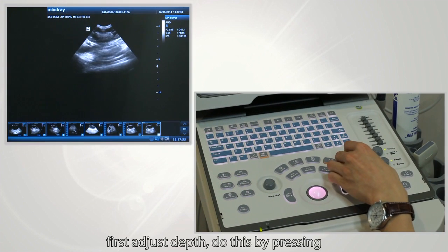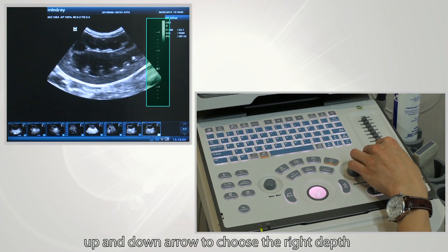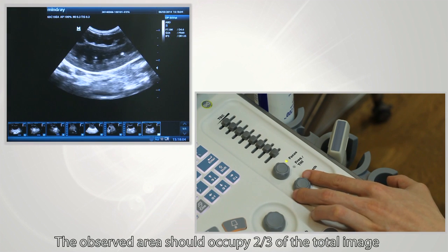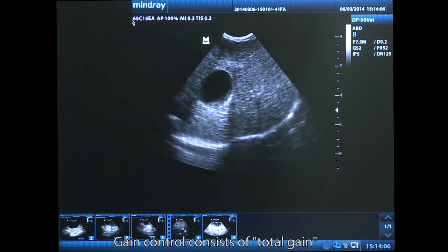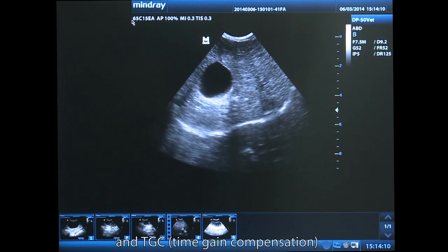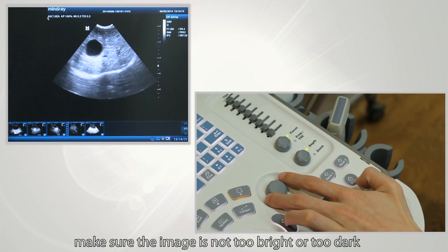First, to adjust depth, press the up and down arrows to choose the right depth. The observed area should occupy two-thirds of the total image. Gain control consists of total gain and TGC, which means time gain compensation. First, adjust total gain to make sure the image is not too bright or too dark.